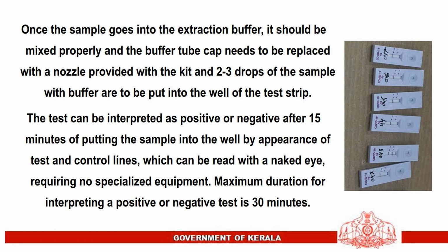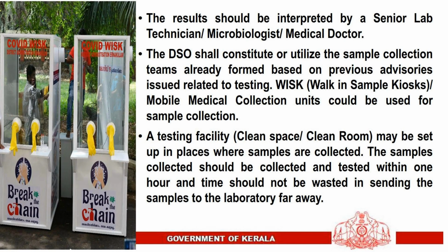The test can be interpreted as positive or negative after 15 minutes of putting the sample into the well, by appearance of test and control lines, which can be read with the naked eye, requiring no specialized equipment. Maximum duration for interpreting a positive or negative test is 30 minutes. The results should be interpreted by a senior lab technician or microbiologist or medical doctor.